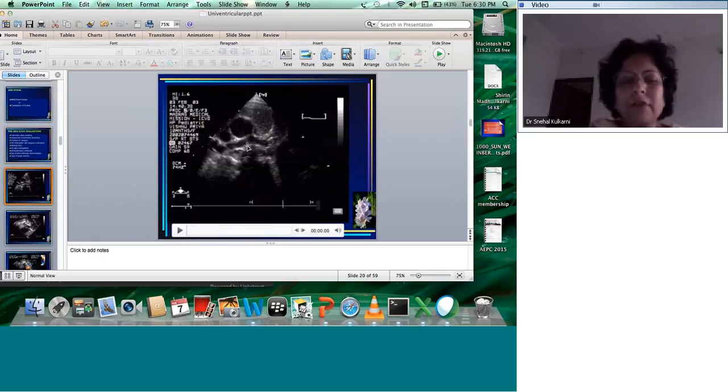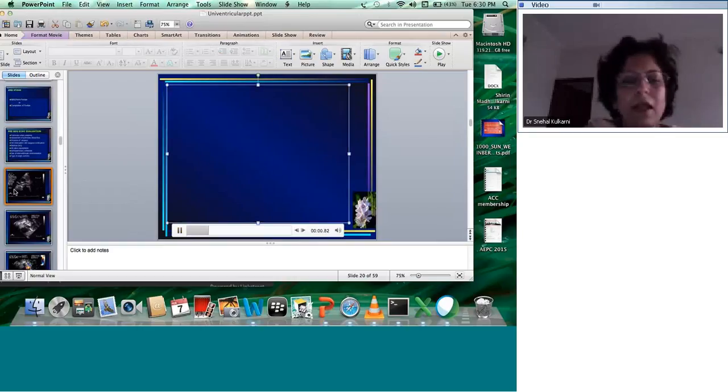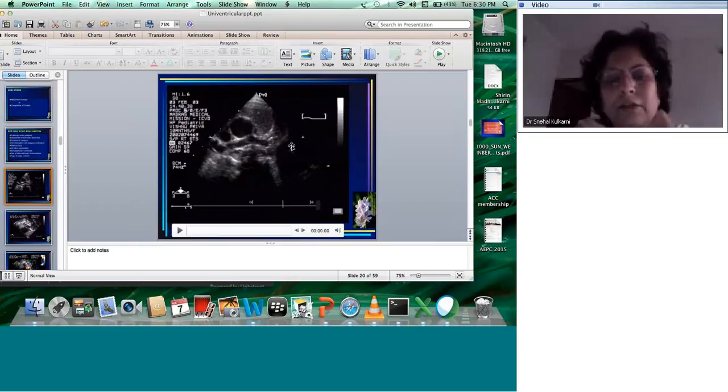This is just showing you. As I said, I don't know why the videos are not working, but I'm just trying to show you that you should try to see pulmonary arteries as well as possible, to see the Z-scores and see that they are in an adequate range, so there is a high possibility that your Glenn will function better.